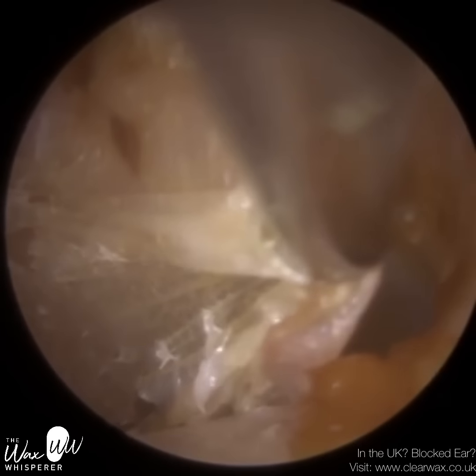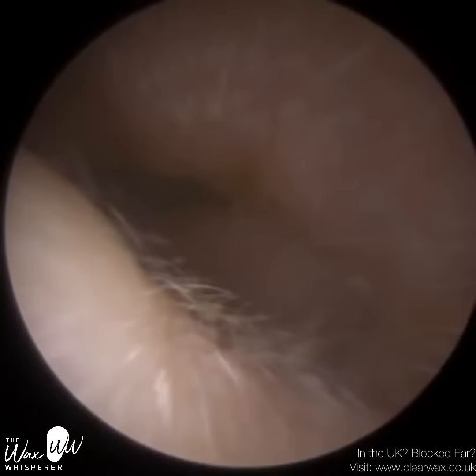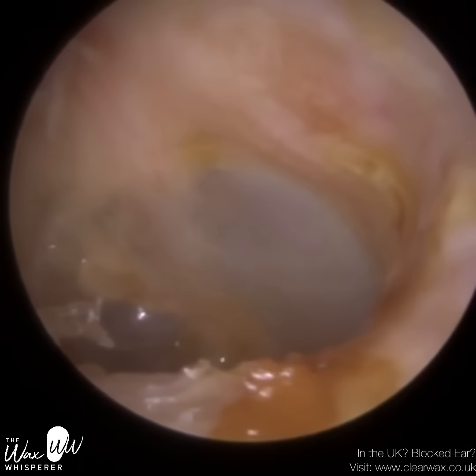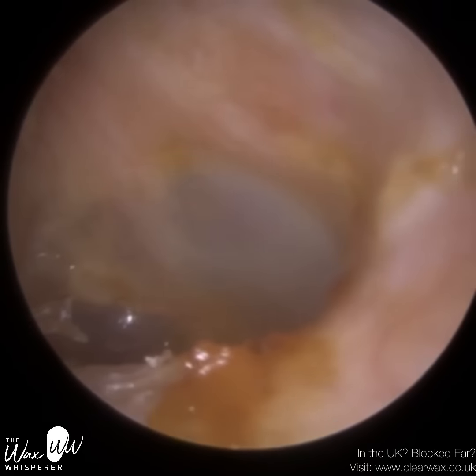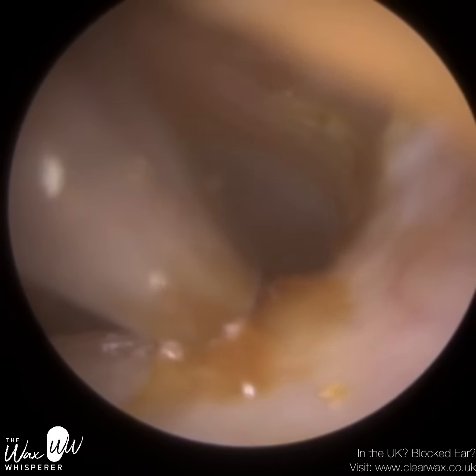And sorry, the reason why I was talking about the perforation a lot more is because the right one, when you see the perforation, it's a very small segment of the video, so I wouldn't have time to explain it all. There's the patient's eardrum at a distance. There's a bit of mushy wax just coating the bottom of the ear canal. I'm going to quickly hover over. If it comes away, brilliant. If not, it's not going to do any harm.